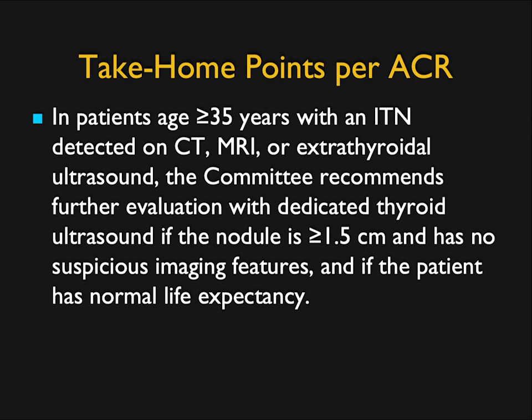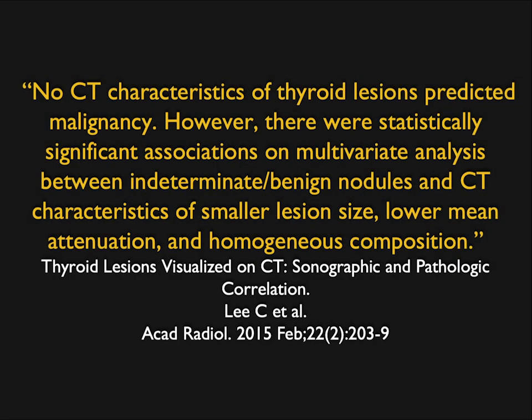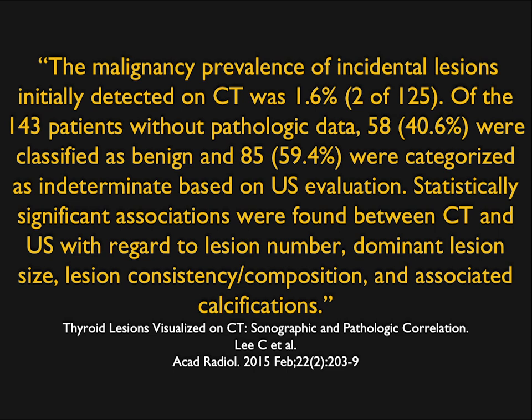So again, it's difficult. Lee wrote this article. There are no definitive guidelines for management of thyroid nodules on CT. They looked at it closely. They tried to find specific findings on CT besides invasion that would allow you to say benign versus malignant. There were statistically significant associations on multivariate analysis between indeterminate benign nodules and CT characteristics of smaller size, lower attenuation, and homogeneous appearance. In this article by Lee, the malignancy prevalence of incidental lesions was under 2%. So again, you can see the challenge. How exactly do you manage these patients?